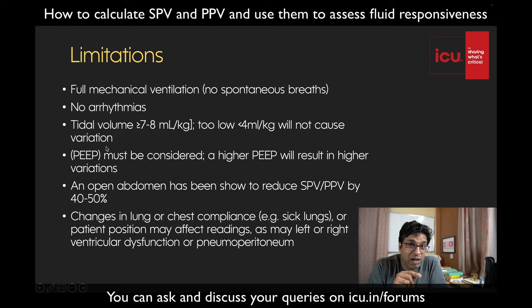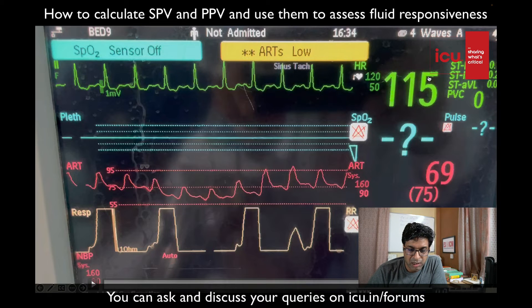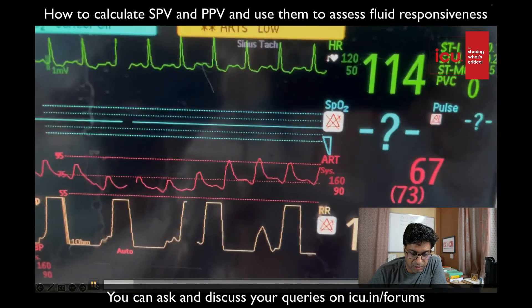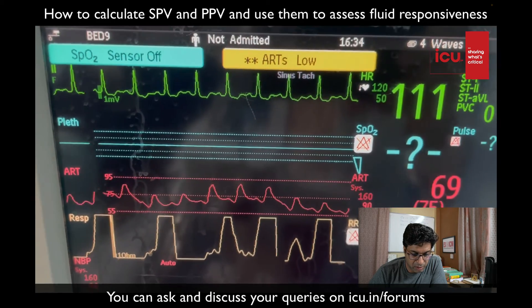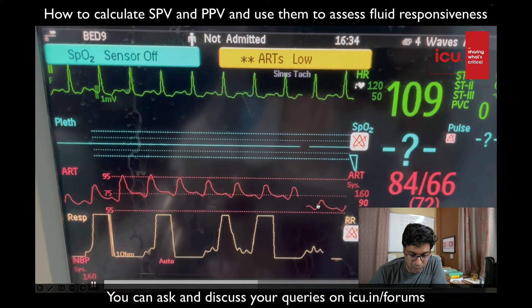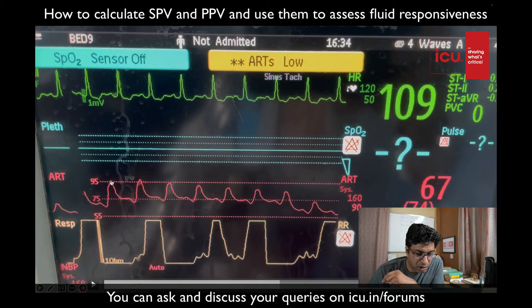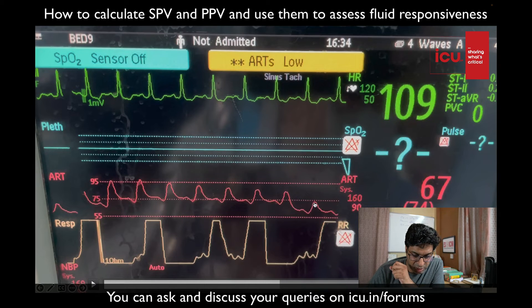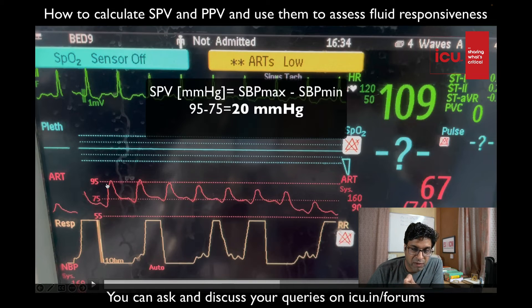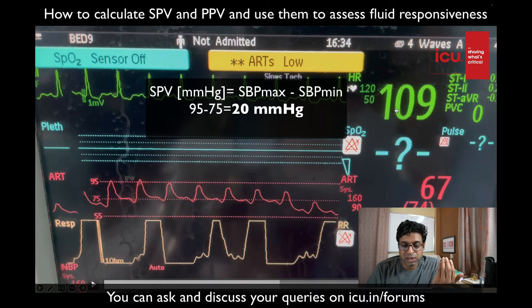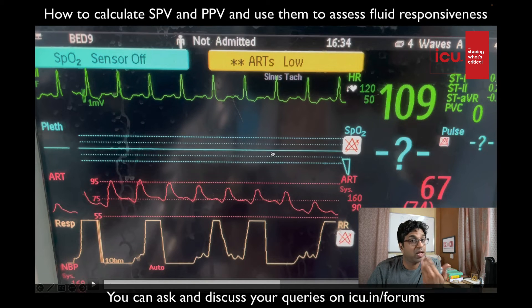Now let's look at the live ICU recording. This patient has a heart rate of 115. You can see the arterial trace — the highest value touches around 95 and the lowest is around 75. Calculating SPV: 95 minus 75 equals 20 mmHg, which is more than 10 to 15 mmHg, so this patient can be considered fluid responsive. Additional clues are that the patient is slightly hypotensive and tachycardic, so we can give fluid to this patient.